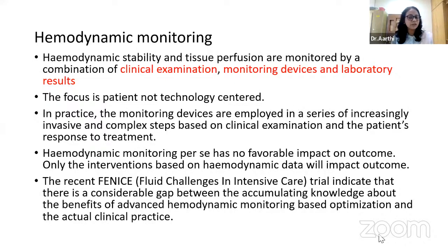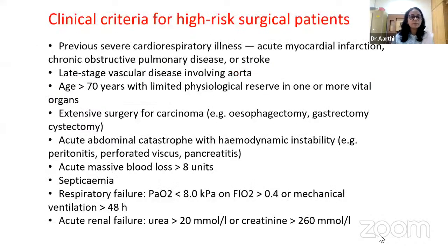In practice, monitoring devices are employed in a series of increasingly invasive and complex steps depending upon clinical examination and the patient's response to treatment. The recent fluid challenge in intensive care trial indicated that there is a considerable gap between accumulating knowledge about the benefits of advanced hemodynamic monitoring based on optimization and actual clinical practice.